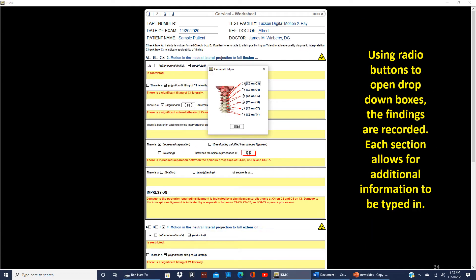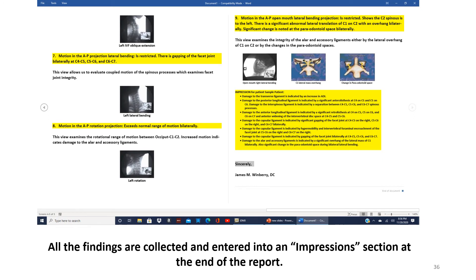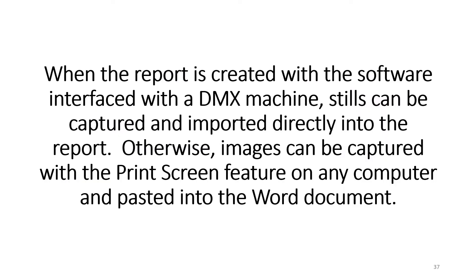Using radio buttons to open drop-down boxes, the findings are recorded, and each section allows for additional information to be typed in. At the conclusion of the IDMX software, when all the information has been entered, a report is created in Word format at the touch of a button. All the findings are collected and entered into an impression section at the end of the report. When the report is created with the software interface with the DMX machine, stills can be captured and imported directly into the report.